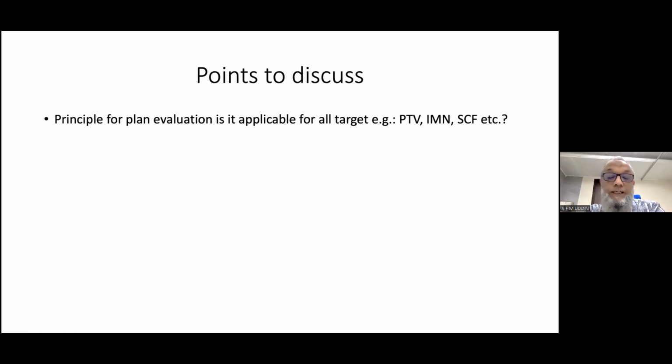So always, as a clinician, we need to make a call on where to stop and how much to do when you are in an ideal world. But when you don't have everything, then again we need to find a way. But still, as he said, the field in field forward IMRT is still more or less one of the best solutions for all situations, especially RNI.